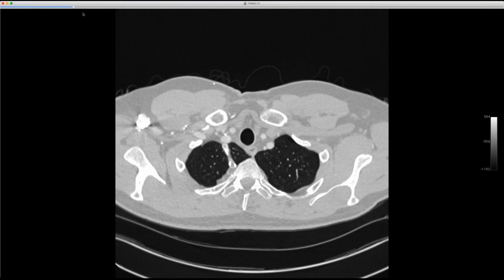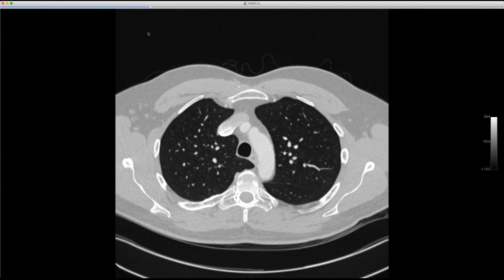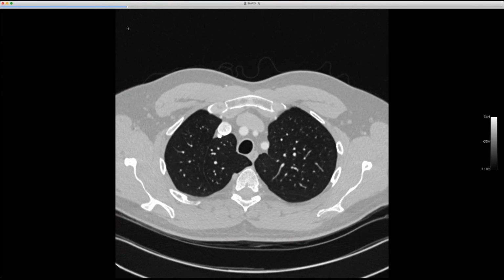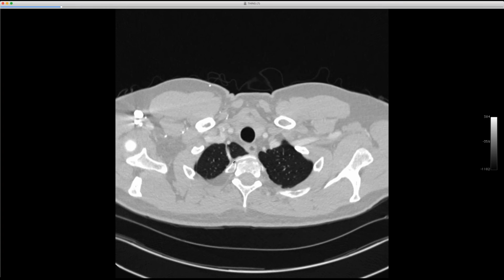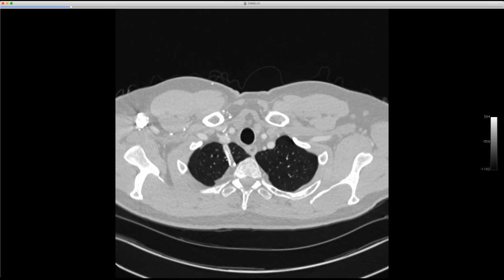This is the same case. Oh, yeah, I've shown it before. Wait a minute. No, wait a minute. Or maybe we were talking about it, and you just sent it to me or something. But I think it's the same one, because there's the fissure, and here's the azygous coming up high, and there's that little mesoazygous.